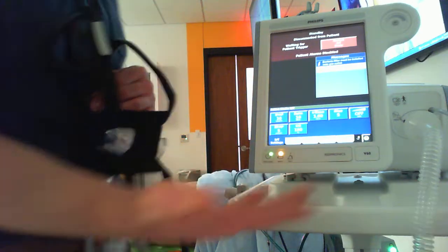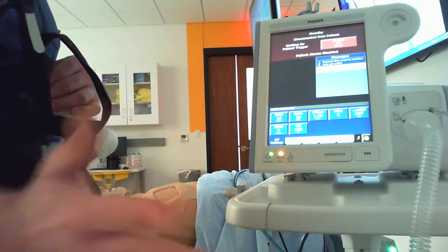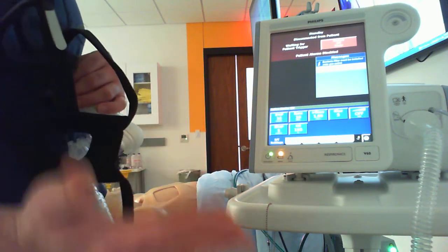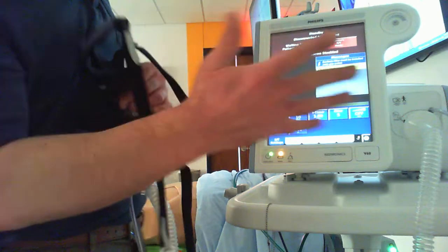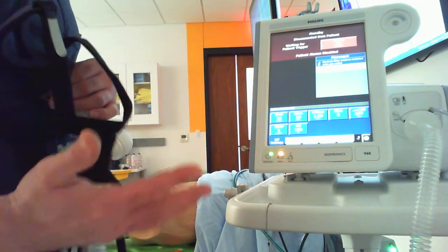I usually set a rate at 10, something low and back up, give my patient a 6-second buffer where if they don't trigger it's going to kick in, but not high enough where it's going to interfere with their active breathing. I time is not going to do anything unless a time-triggered breath is taking place or one of these rate breaths, so it doesn't really matter, but it's not going to typically kick in, but you do want to make sure you have it set appropriate in case something does happen and they can't trigger.